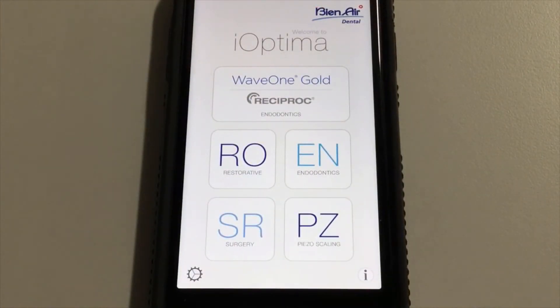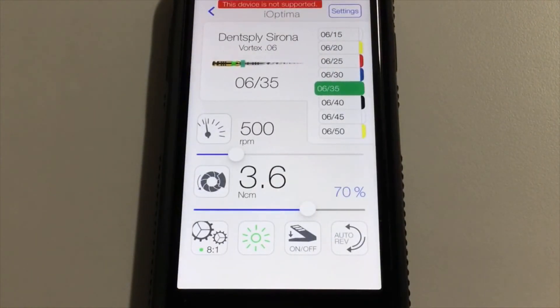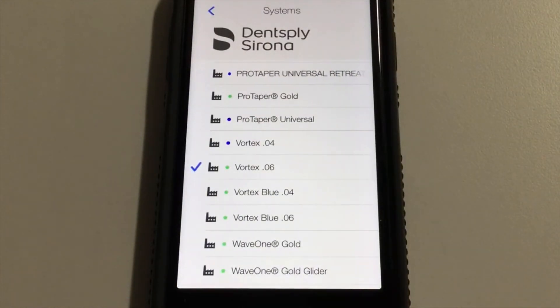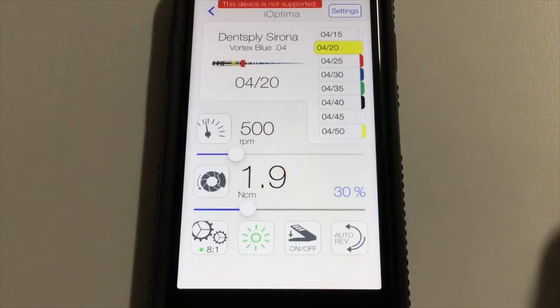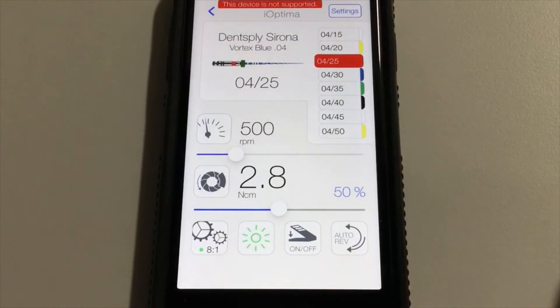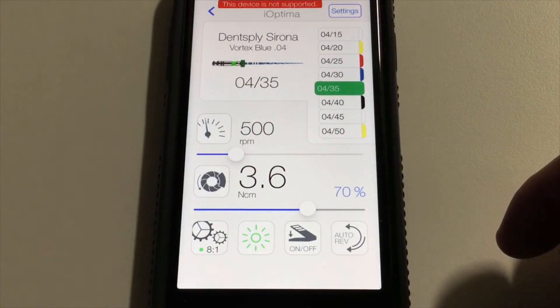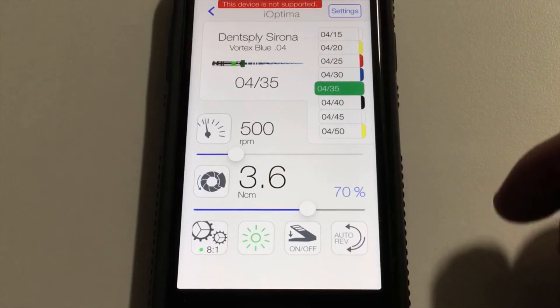For endodontic procedures, there are two options. The first would be for rotary endodontics, which would be the EN function. If I go to settings, it comes pre-programmed with all of the different file systems from Dentsply Tulsa. You can pick your program and it will remember the speed and torque for each file in the endodontic sequence. As you can see, as I go through the different files, the speed and torque settings are changing to reflect the manufacturer specifications. You would always have the capability of adjusting those speed or torque settings based upon your clinical needs and then saving those changes.